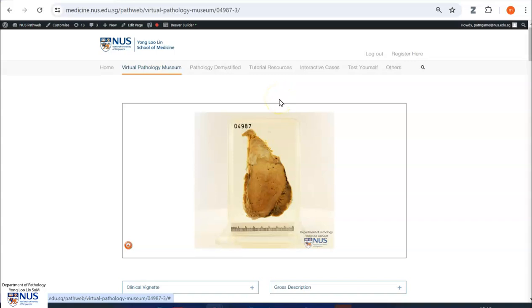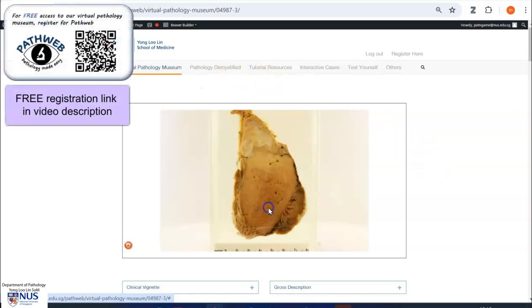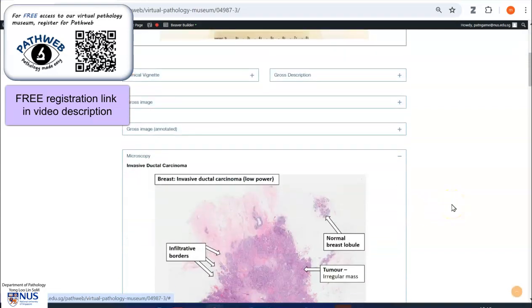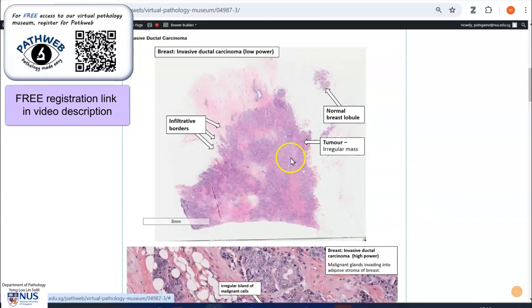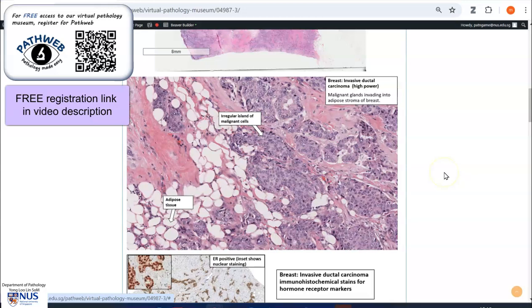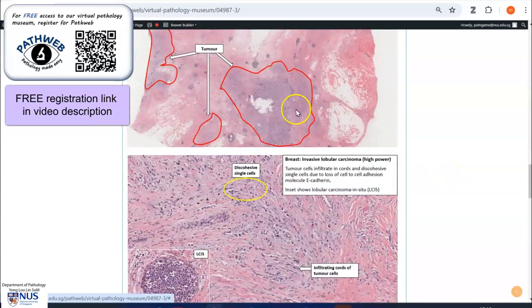This is a page from our Virtual Pathology Museum. In our free online pathology resource PathWeb, you can see the maneuverable virtual pathology specimen. If you scroll down, you will also be able to see annotated microscopic pictures of both invasive ductal carcinoma and lobular carcinoma.